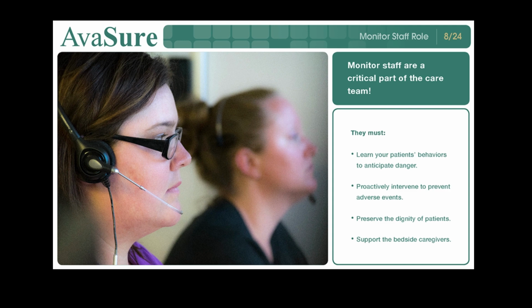Monitoring staff are a critical part of the care team. They must learn patients' behaviors to anticipate danger, proactively intervene to prevent adverse events, preserve the dignity of patients, and support the bedside caregivers. We will discuss the interaction necessary between RN caregivers and the monitoring staff shortly. But for now, let's talk a little bit about privacy and dignity.